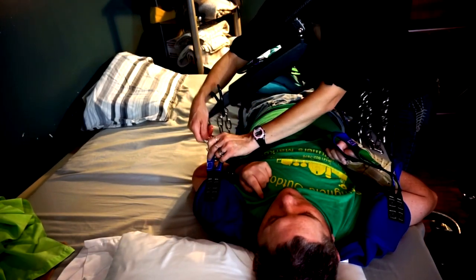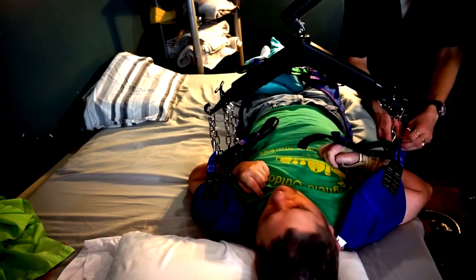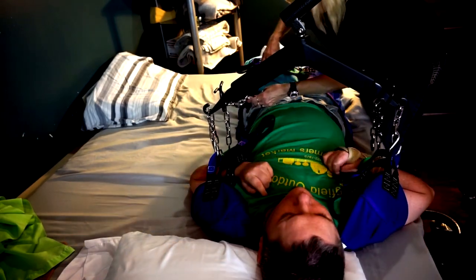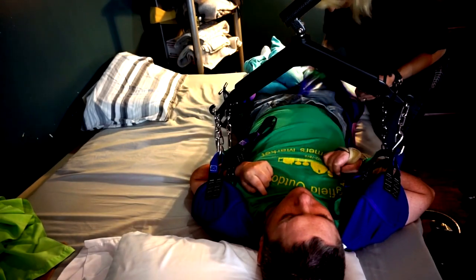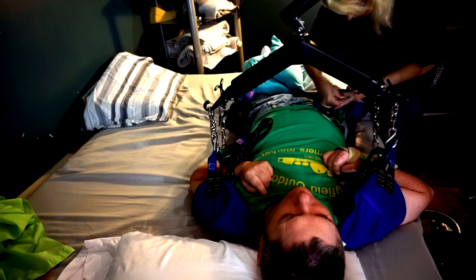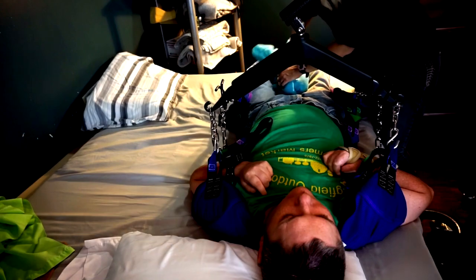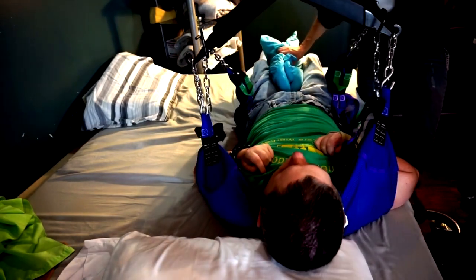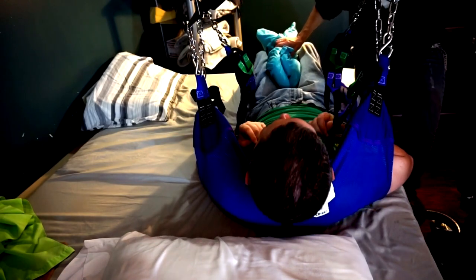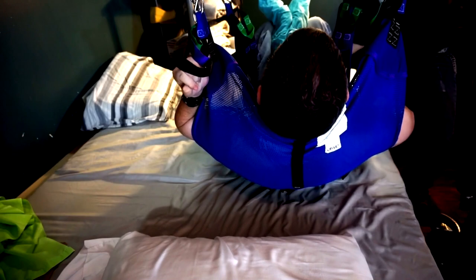A lot of people put the sling right to the Hoyer, but I actually use the chains — I think it works better doing it that way, it's a little more spread out so I don't get my head smooshed or my legs smooshed together too much. Then I pump the sling up and raise myself up.